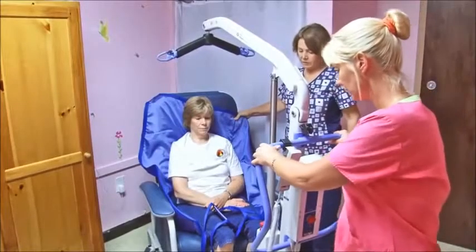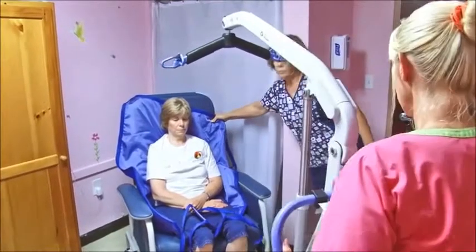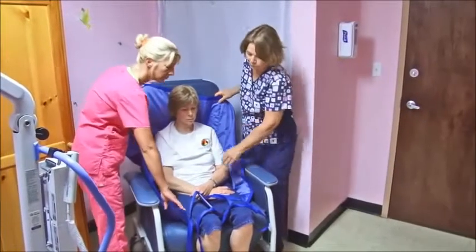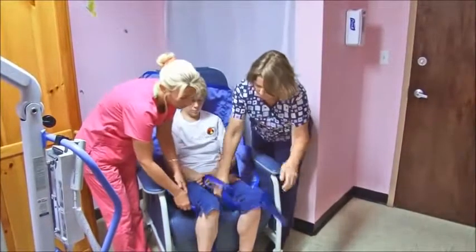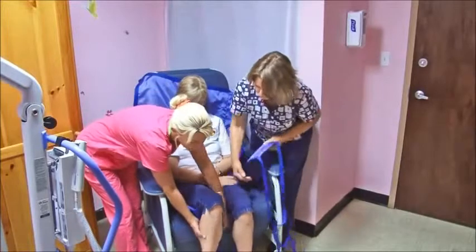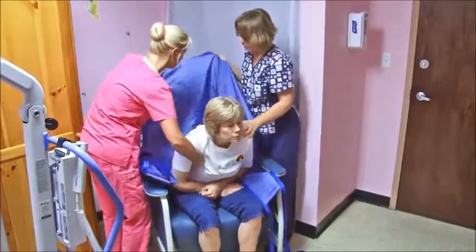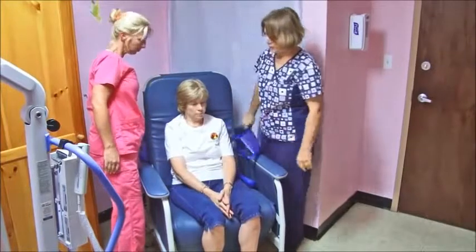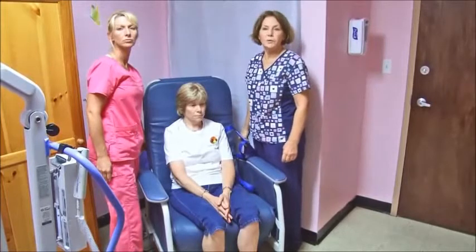Very good. Remove the Hoyer lift from the resident and then remove this. Do it that way. Okay. And now we're going to remove the sling from behind the person and under the person. First you have to uncross the legs, and it helps to slide it under a little bit so that it's out of the way. Now you can ask the resident to move forward, and we can remove the whole sling. And there you have your patient or resident moved to a sitting position.